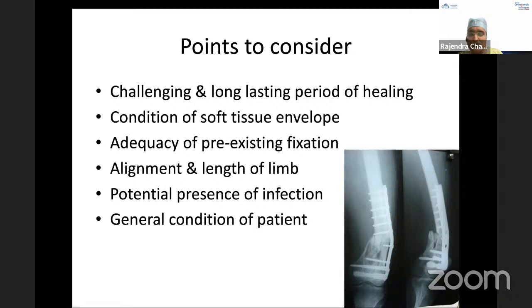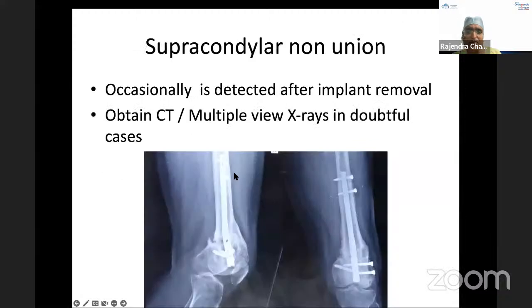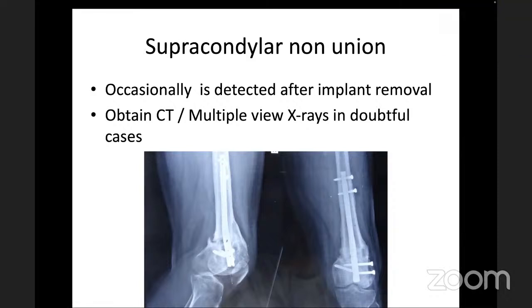So now the choice of implant for all these three cases, for this patient is different, for the previous patient it is different. So you have to think about what would be the best modality of fixation. Now think on this non-union. The point of presentation in this case I am elaborating is for every distal femur non-union, you need to think about implant, what would give you the best fixation in this situation.